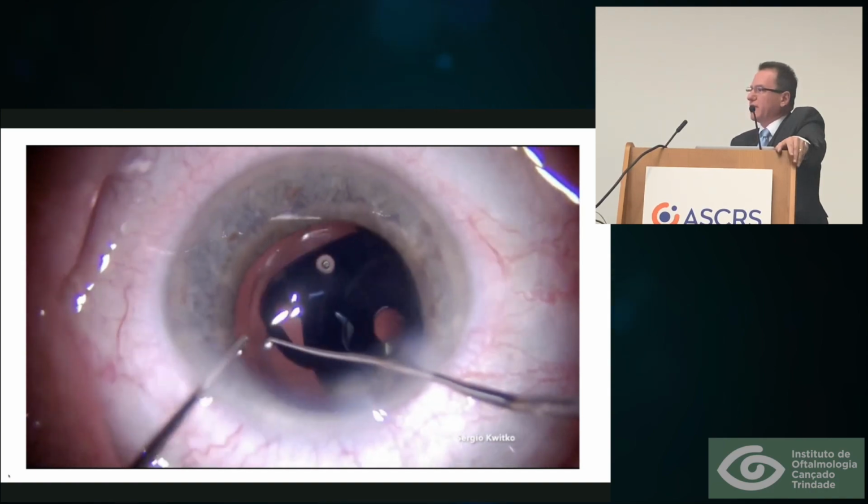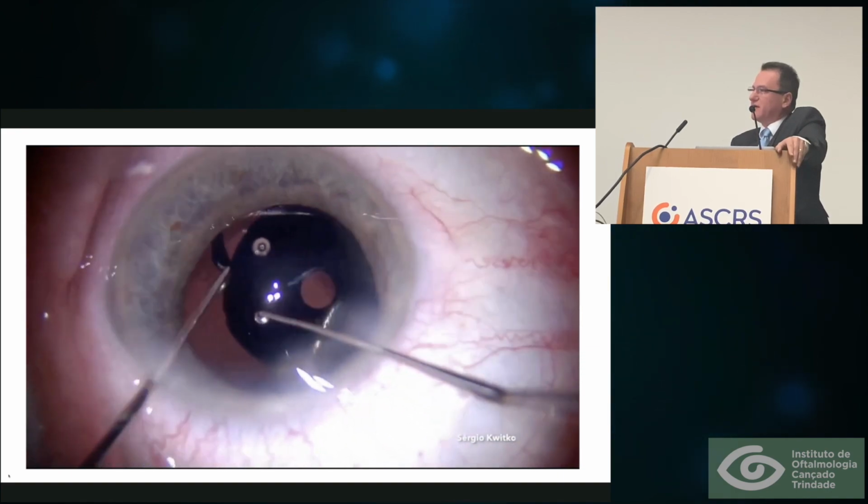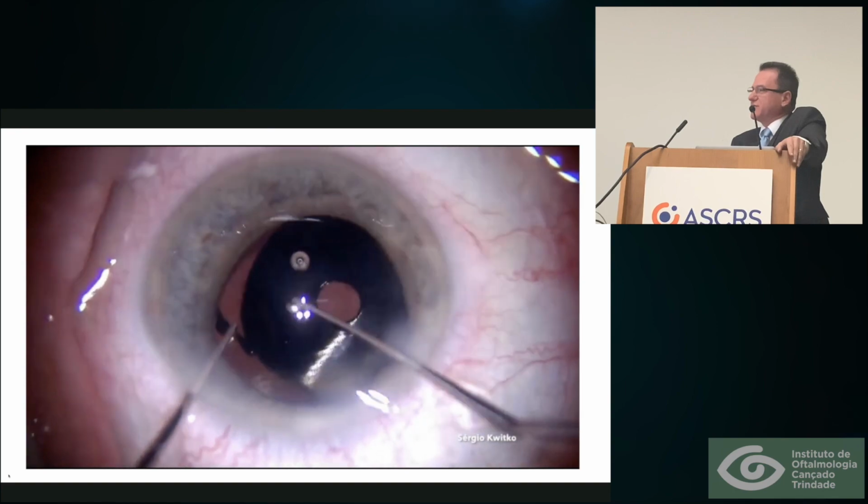So now I'm trying to implant inside the bag. It's tougher because it's hard to see, but sometimes it's possible.